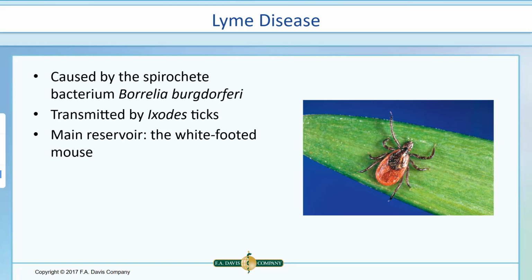When the tick does come to the laboratory, if the patient pulls off the tick, sometimes they want to culture the mouth parts to see if the tick was carrying it, but then there's some tests that we can do on the patient as well. When they get to the adult stage like this, it's really easy to identify what the deer tick is, and it's important to note that not every deer tick has the bacterium. A lot of them do, especially in Wisconsin, and there's various random sporadic regions around the United States that have them, but especially in like the New England area of the United States. But just because this tick has been attached to you doesn't mean you're going to get Lyme disease.